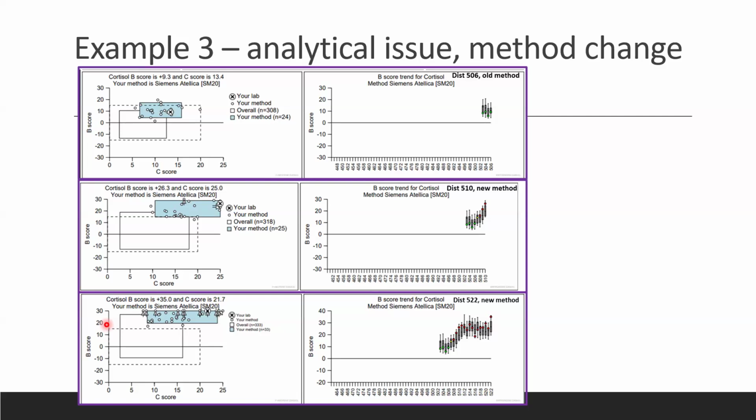And given that the problem was noticeable not only with the EQA, but also with patients, it implied that it's more likely to be a problem with the method rather than the EQA or similar. And therefore, the manufacturer was contacted, and this was brought to their attention. As the new method was rolling out through other labs, other users of the same method around the world were also reporting the same positive bias.